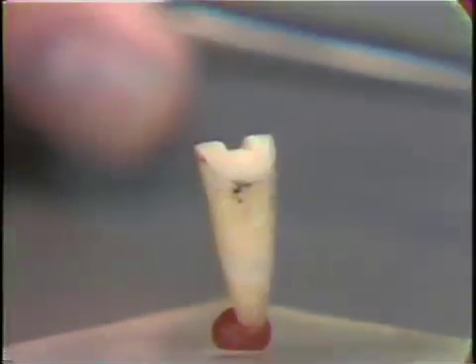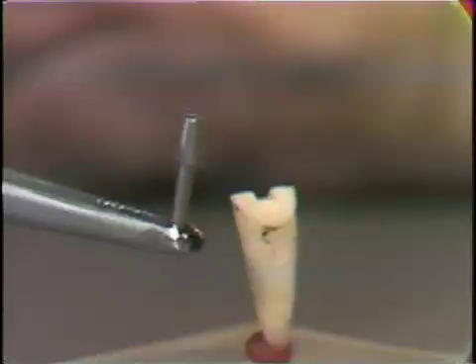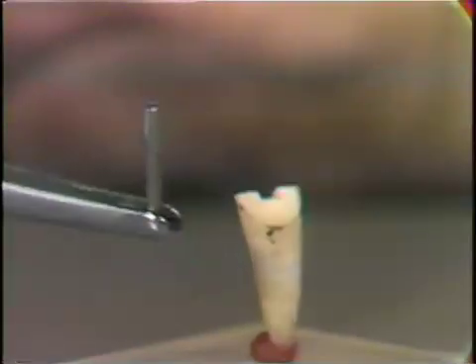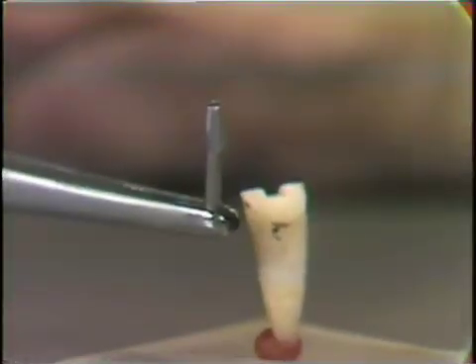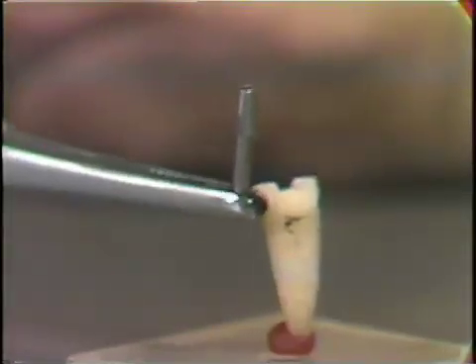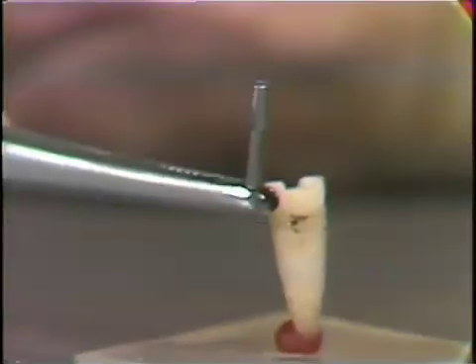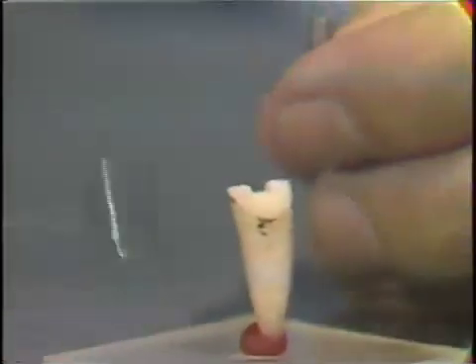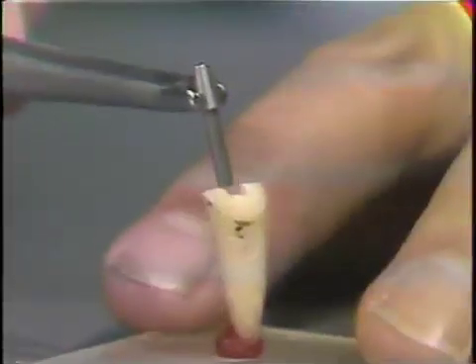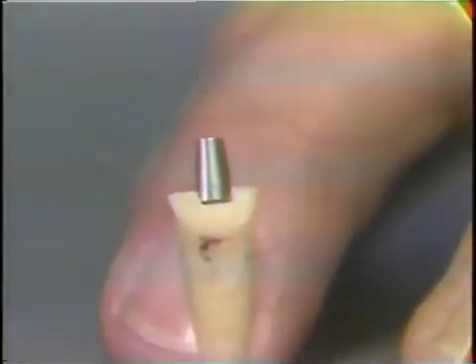Now the post which goes into this particular preparation is this one here, which comes as a prefabricated post, and this is exactly the shape as you receive it. A drill is supplied which drills a hole down the root canal exactly to match that post, and that is drilled and the post fitted. And if I can just put it in position here, see how the flats on the post slip down into the slot on the top of the preparation.